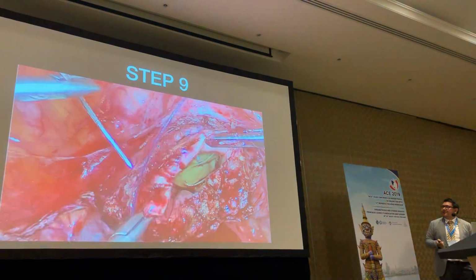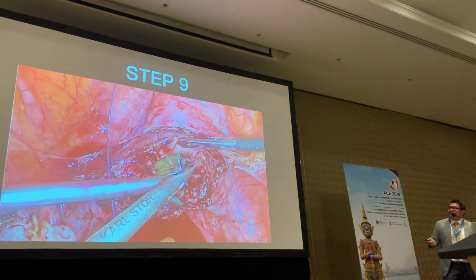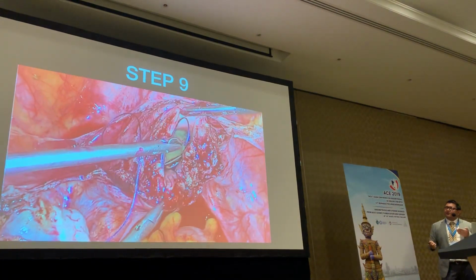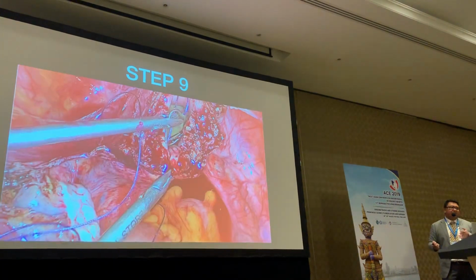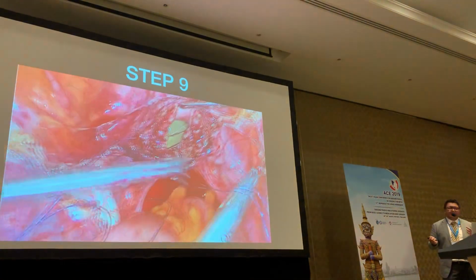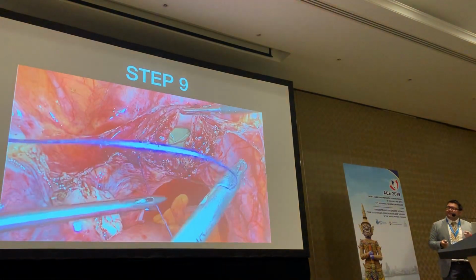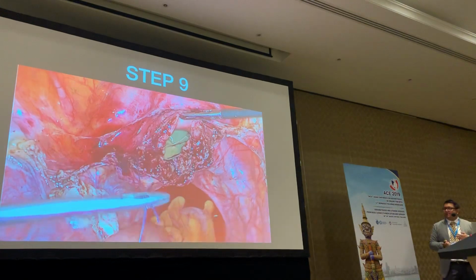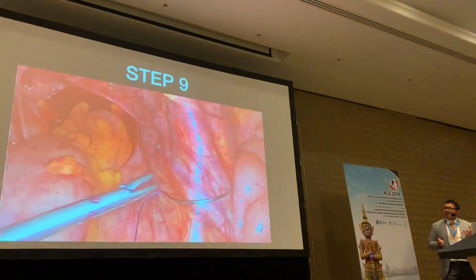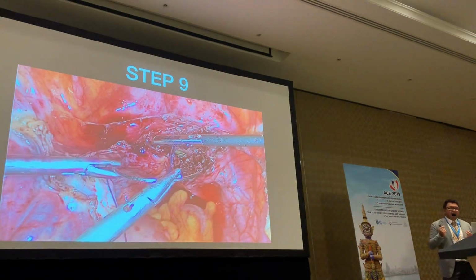So coming down to vaginal closure, I suture with my left hand for the left angle, because the needle holder should be parallel to the incision. The vagina is very forgiving, so you could probably get away with suturing with your right hand. I still will take my lower angle through the uterosacral as an added measure of support. This one was not a very thick vagina, so I will do a single layer closure, provided you take full thickness.